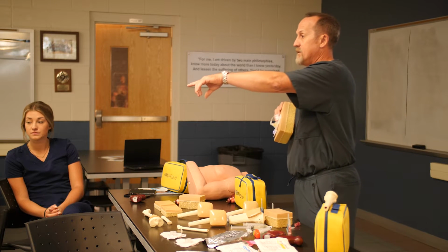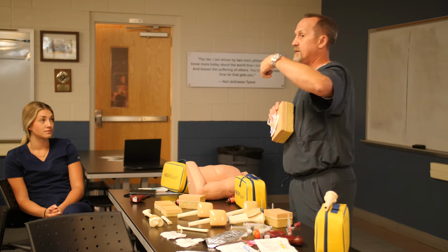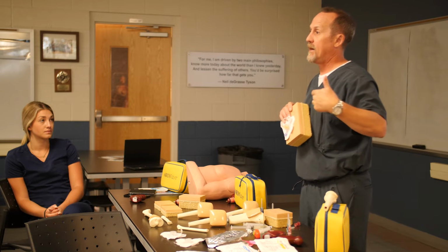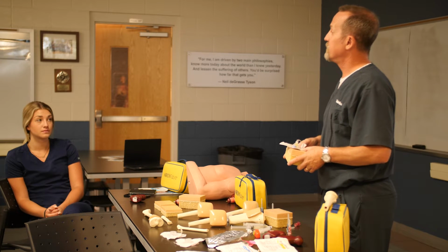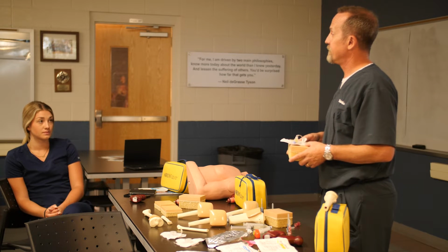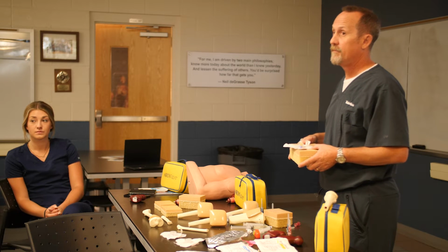I did put some pamphlets on the tables here, little pocket guides that have drug references that tell you everything that's compatible with the IO. Okay? Blood can go through that too. Yes. Whole blood products go through here as well. Remember, it's a 15 gauge as well, so it does have some significant flow.